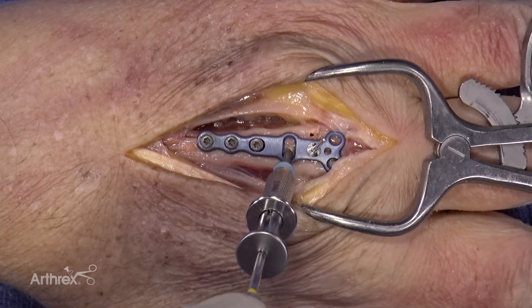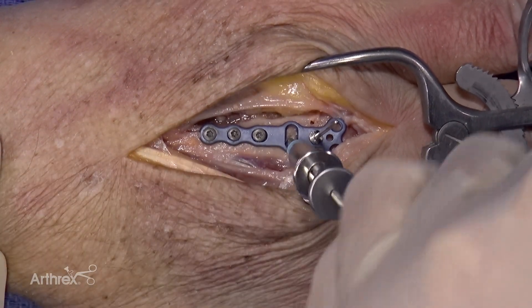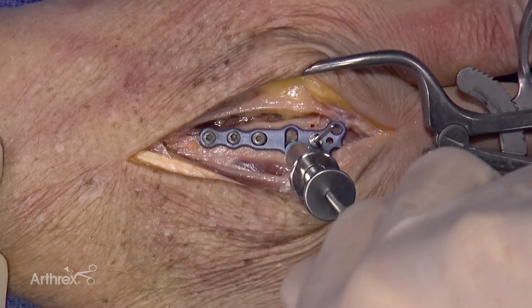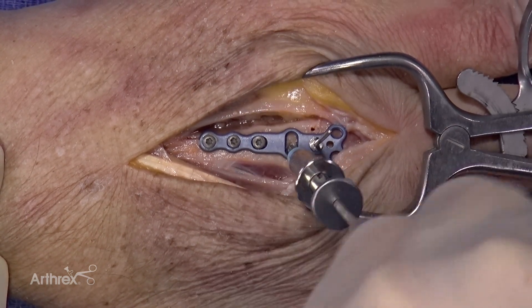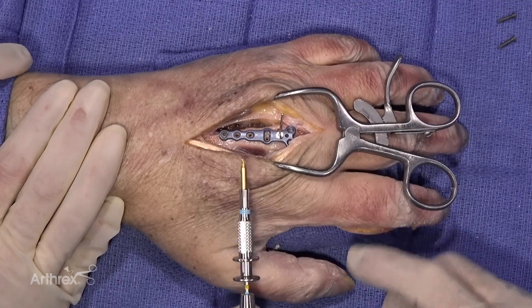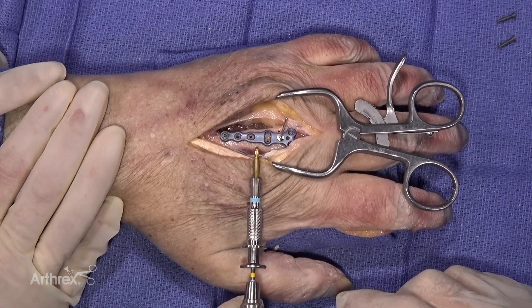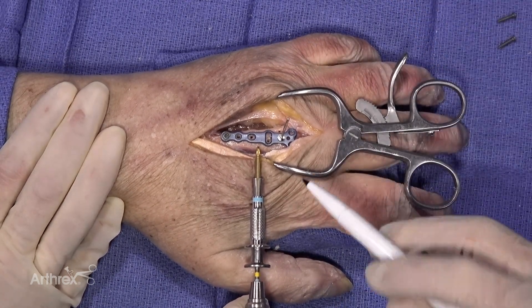The screw is placed but does not require a very tight bite at this point as we are going to remove the plate. You can think of this as essentially tapping the screw hole. Once this is completed, this screw is then removed along with the three screws on the proximal side of the plate. Prior to removing the final screw, a marking pin should be used to mark the site of the osteotomy so that it is placed in the appropriate position.